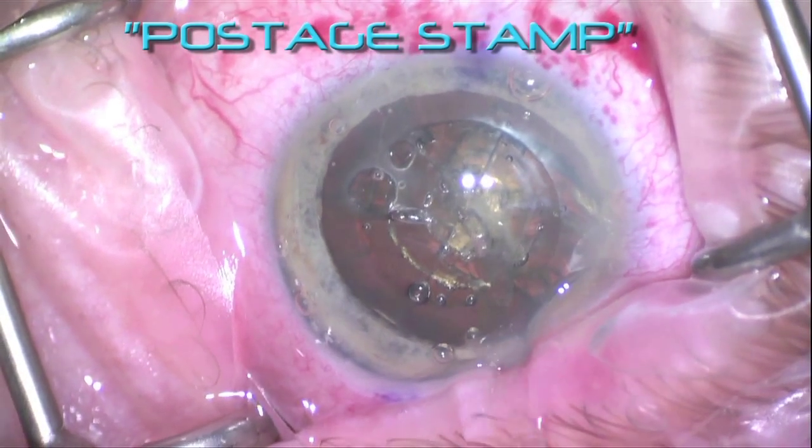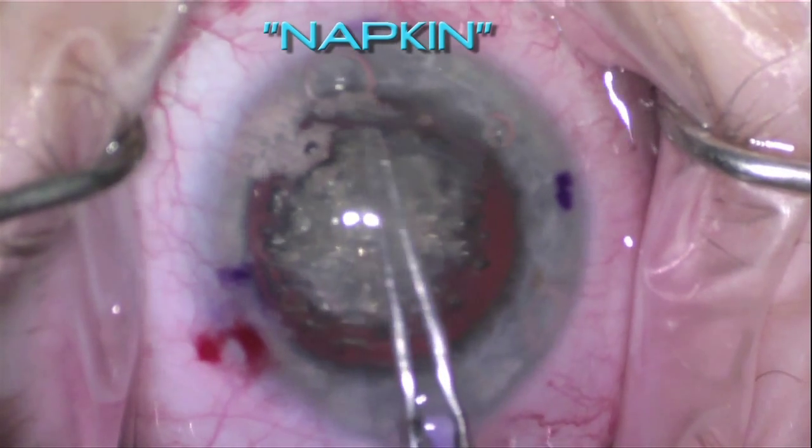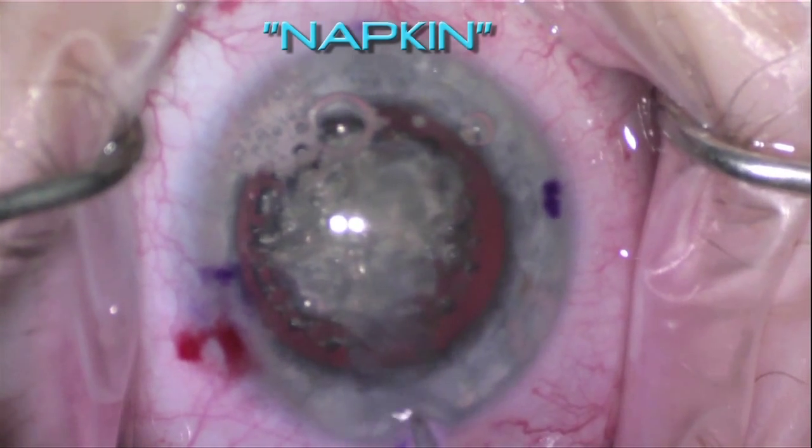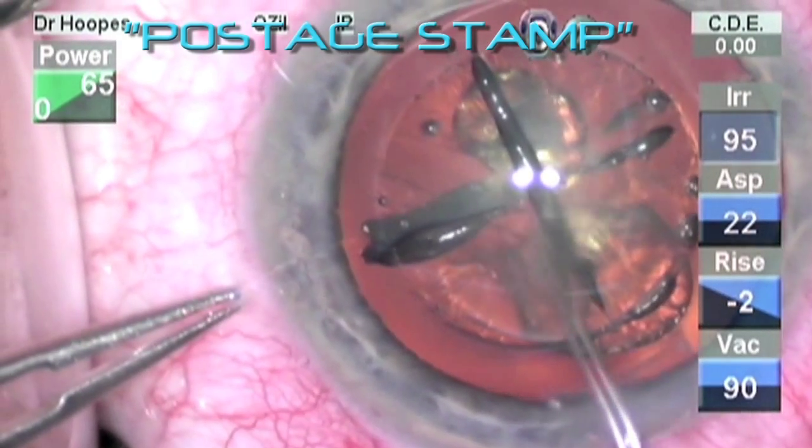Take a look at these video clips, comparing the two procedures, and I think you'll see what is meant by a napkin capsulotomy versus the postage stamp.